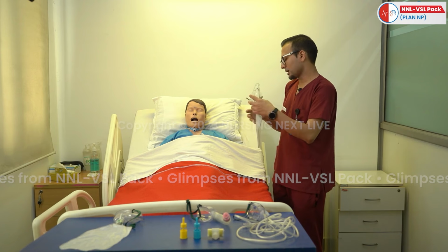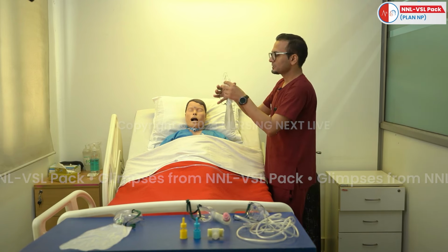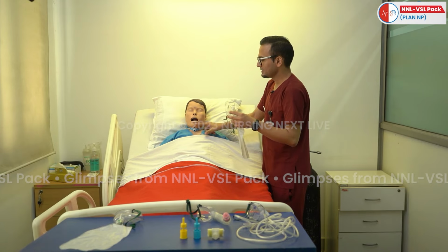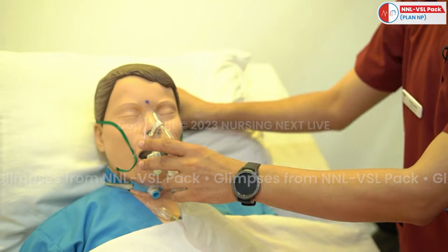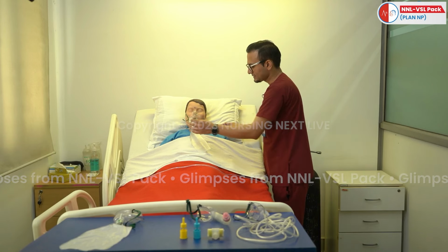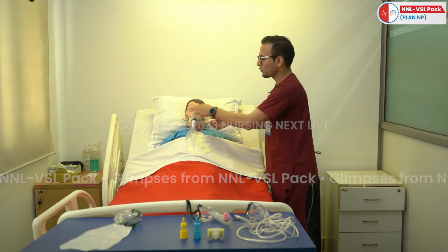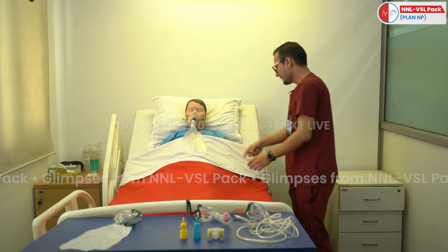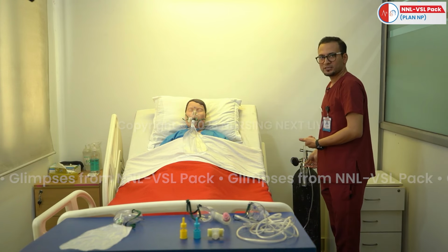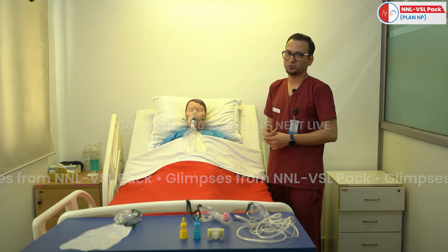Now I will show you how you can attach this mask over the patient. This mask area we are going to cover the nasal and the oral cavity of the patient. Like this you can attach the mask over the patient's face. One end of the oxygen tubing we are going to connect to the mask, and the other end we are going to connect to the oxygen cylinder, and this is how we can deliver the exact amount of oxygenation to the patient.